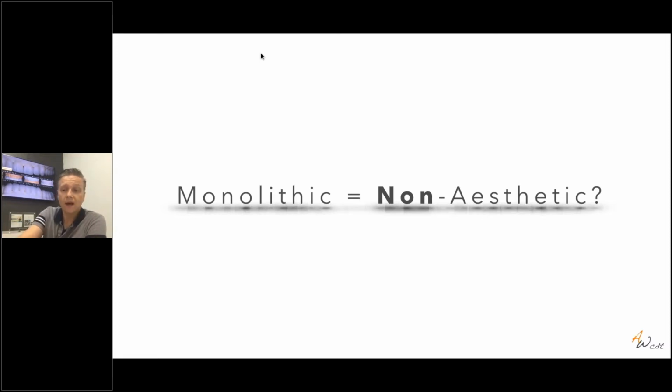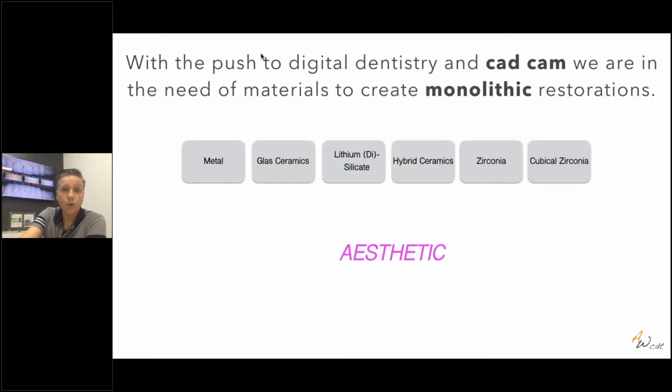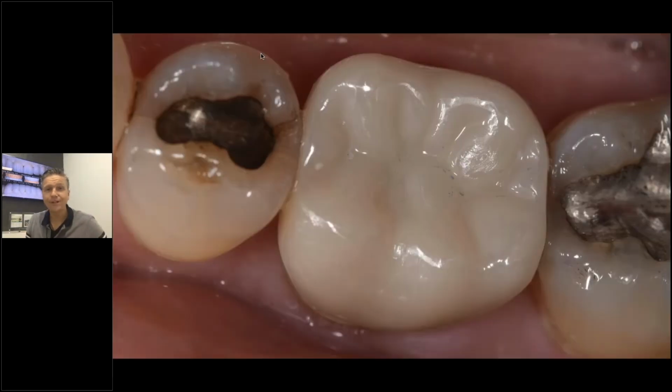I want to take you through a tour of my cases, what I see on a daily basis, and how I do that. So again, monolithic aesthetic, I think it's definitely possible to have aesthetic restorations with a monolithic material. So let's just move forward. Let's look at this, I will say, fully digital crown. It is a monolithic Zirconia seated in a patient's mouth, and not done by me, for sure not.